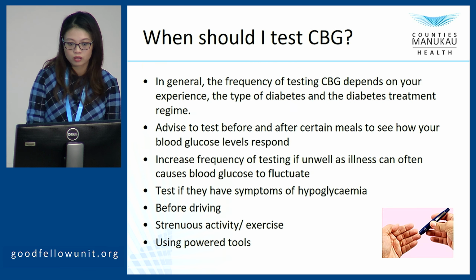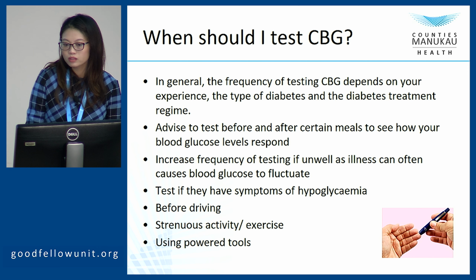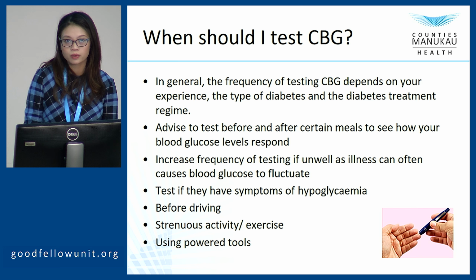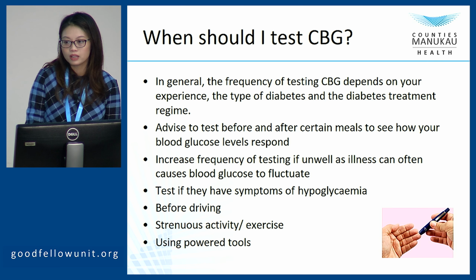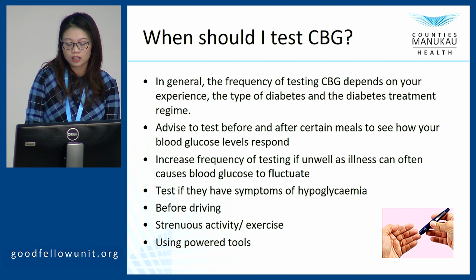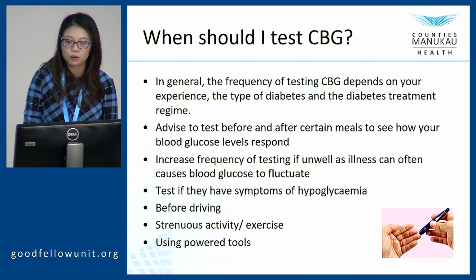So you might ask, when should I test my blood glucose? In general, the frequency of testing depends on your experience, the type of diabetes, or the diabetes treatment. Sometimes we advise patients to test their blood sugar level before and after meals to see how it responds.